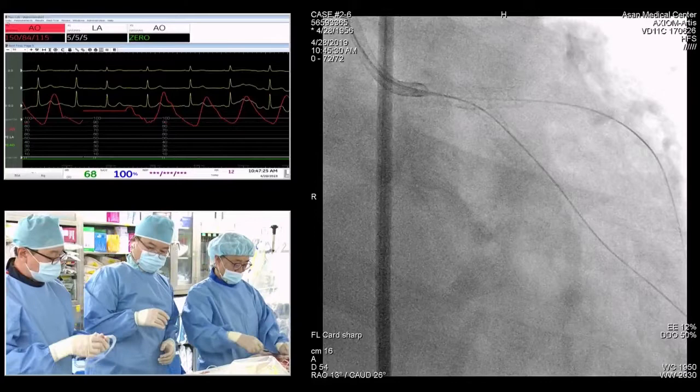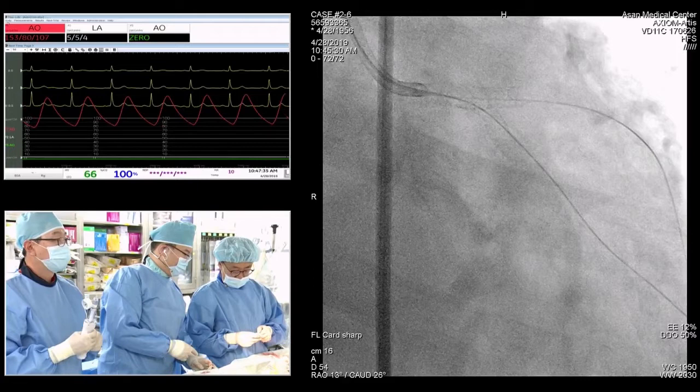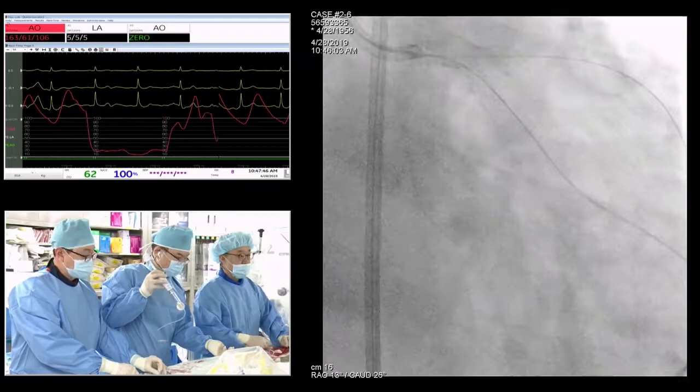DK crush is probably more conducive, especially since we have an angle that's not 90 degrees. Here the angle is more gentle in terms of getting the catheter into the circumflex. Same shoulder. This is 1.5 for side branch reassess. The favorite wire was Choice PT.